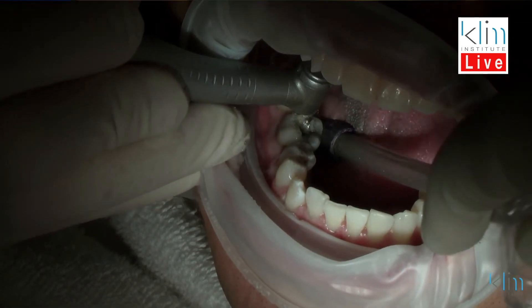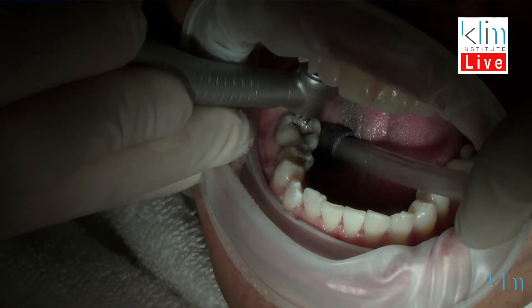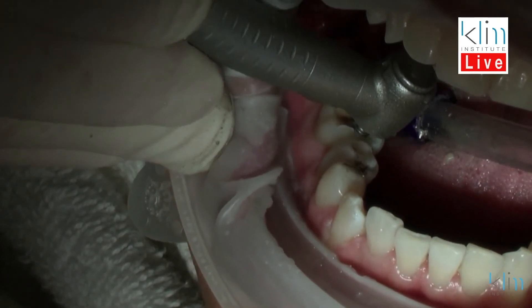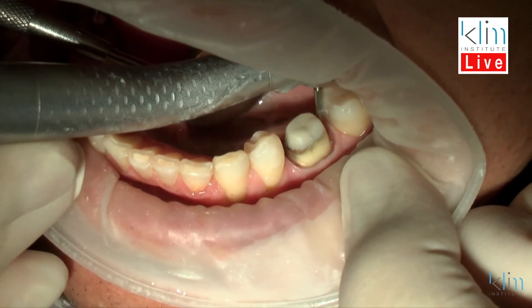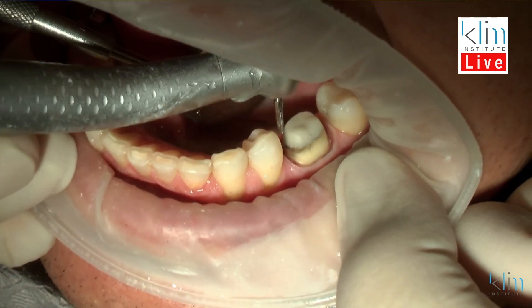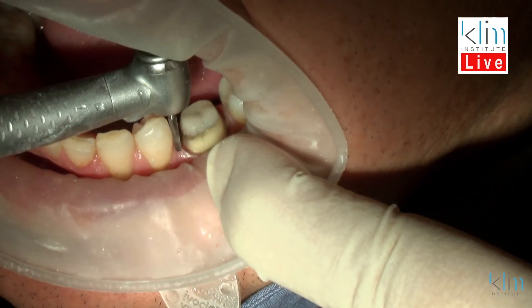Longevity is not as dependent on axial reduction as it is on occlusion. Even though you want to appropriately prepare axially for your material, look at that occlusion because it's really critical. The other way to make your software design flow go well is to make sure you adjust the adjacent proximal contacts to the tooth you're working on if they need to be adjusted — that's how you control your interproximal footprint and embrasures.